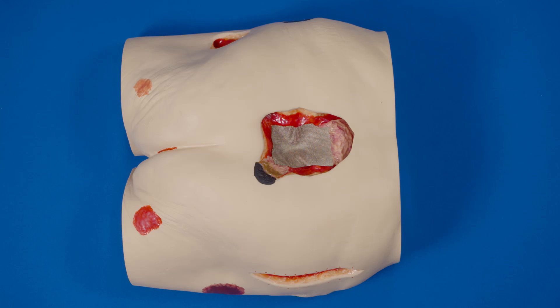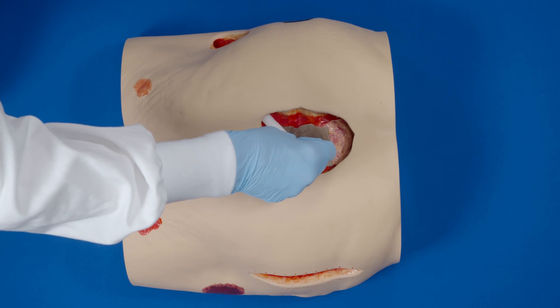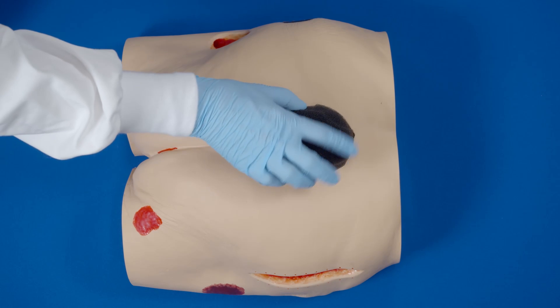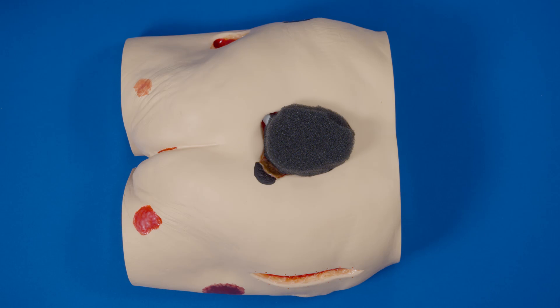If tunneling or undermining is present, consider using white foam. Cut the white foam one centimeter longer than the tunnel or undermining. Place the white foam in and pull back about 0.5 centimeters.